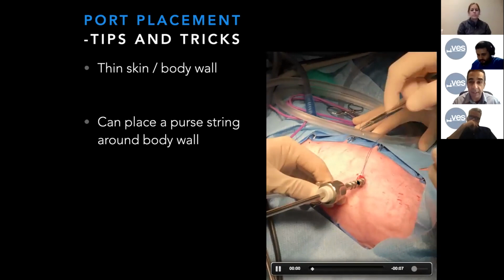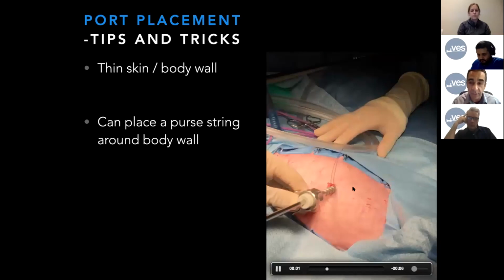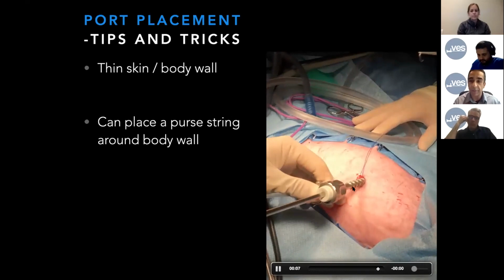I've had this happen where I've had to convert a couple of these cases because of loss of insufflation. And so something to think about, perhaps I should have been using some of the plastic reusable ports, maybe those would have been a better choice than some of these heavier ports.